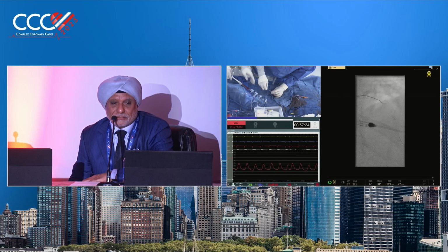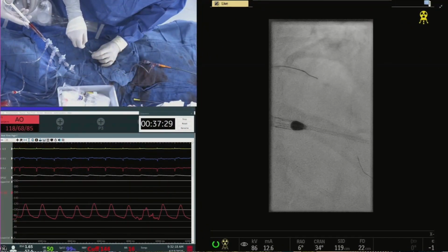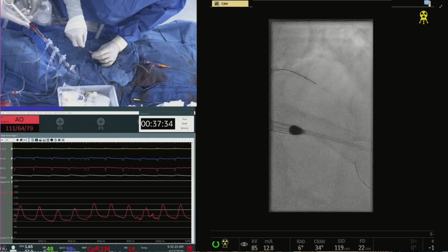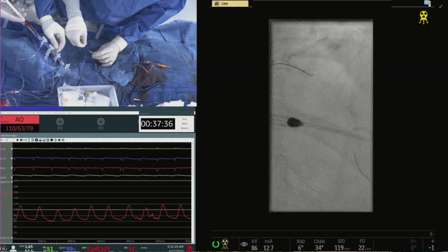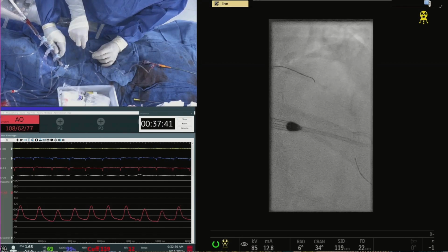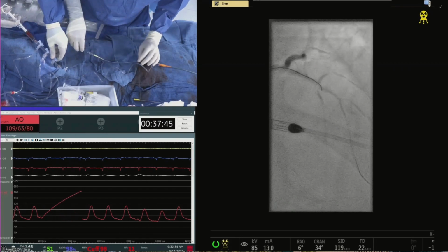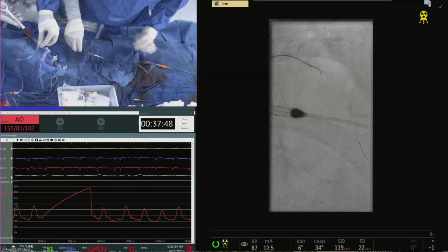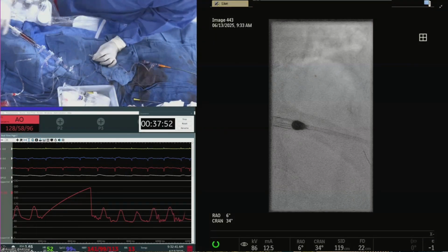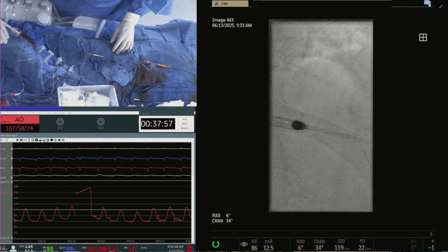Yeah, the Miracle 3 is a nice choice here because you need that extra support to control the wire tip. You got to go retrograde and then go another 180 degrees back anterior. But it may need to be sharper than that. Something tells me you might have to do the diag, it needs to be even a little more angulated. It's tough. Get me Gaia and have a Fighter ready. Gaia 2.